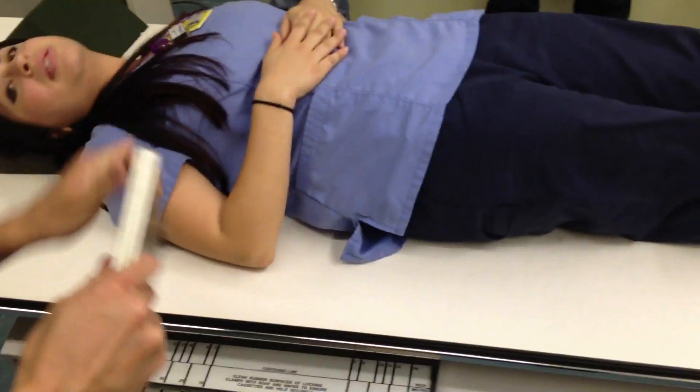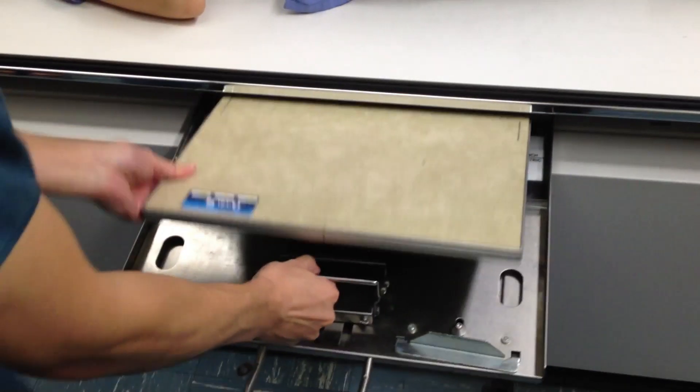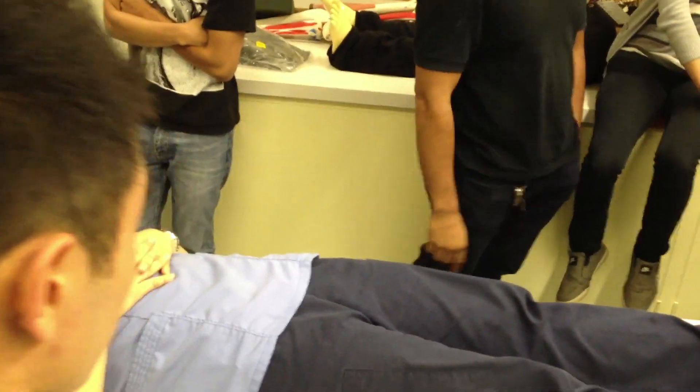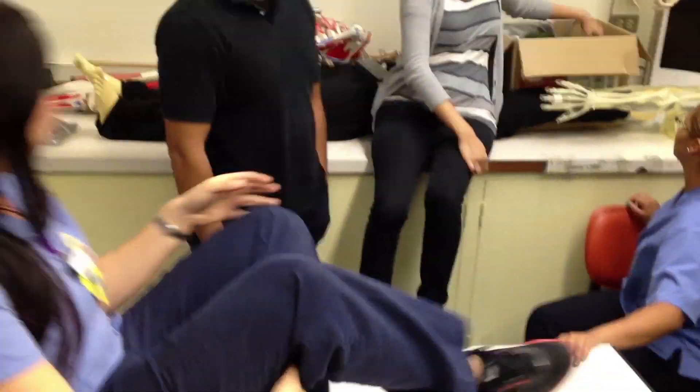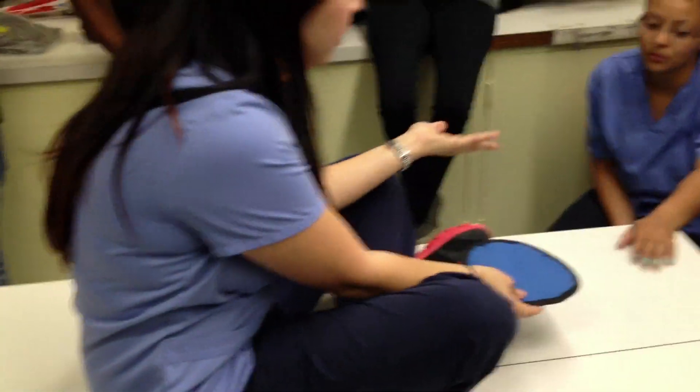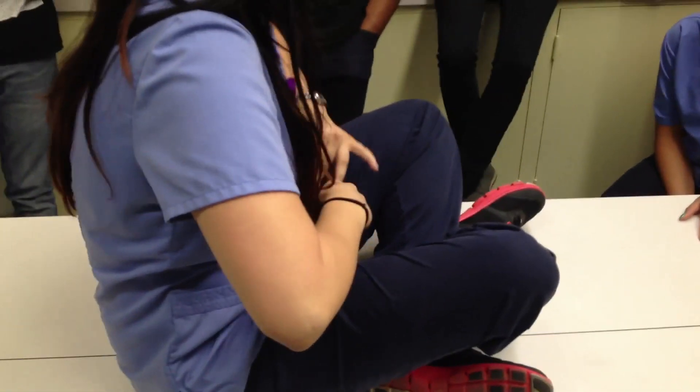Let's do a pelvis and then the lateral hips. For the pelvis, you're doing a crosswise cassette. Does Ms. Ortiz have the shoulder? For your pelvis, you don't want to do the gonadal shield because for females, all your reproductive organs are up in this area.